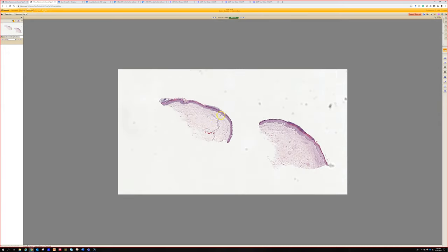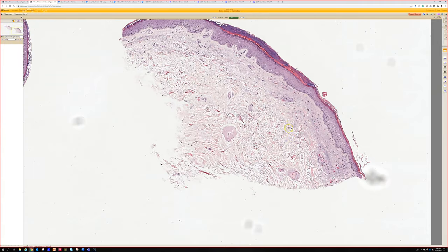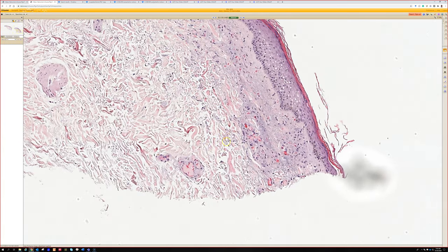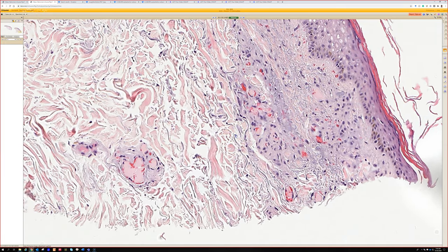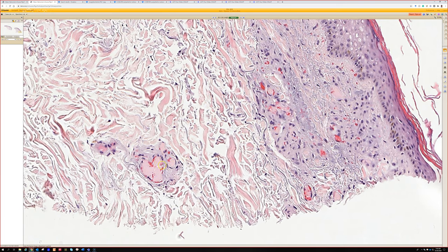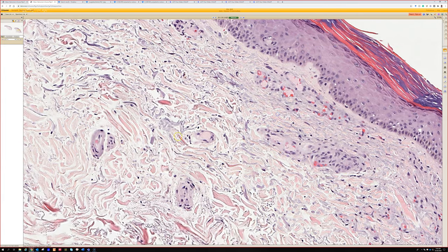Case three — a clip of coagulopathy. In the superficial reticular dermis, there are some vessels that look like very rounded vessels, and they're plugged with pink blobs — pink material. There's some vascular extravasation, but not a lot of inflammation, no features of LCV. So this is more of a vasculopathy type of process — you've got pink blobs plugging up multiple vessels.